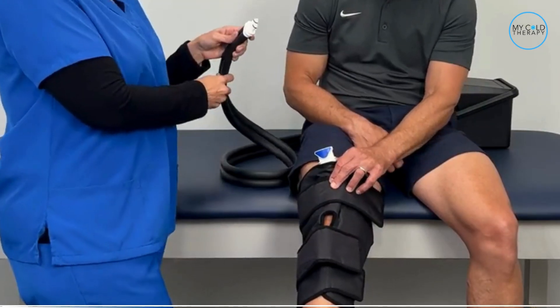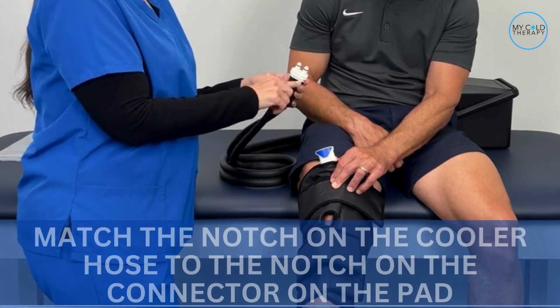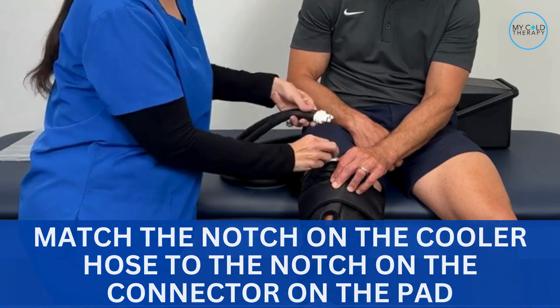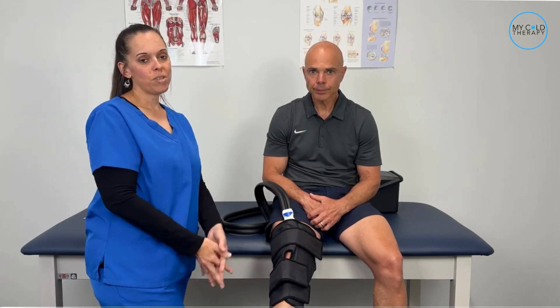Once you've done that, take your hose from the cooler and connect it to the hose on the pad. Make sure you match up the notch on the cooler hose to the notch on the connector on the pad. Once you've connected it into place, you're ready to begin your therapy.